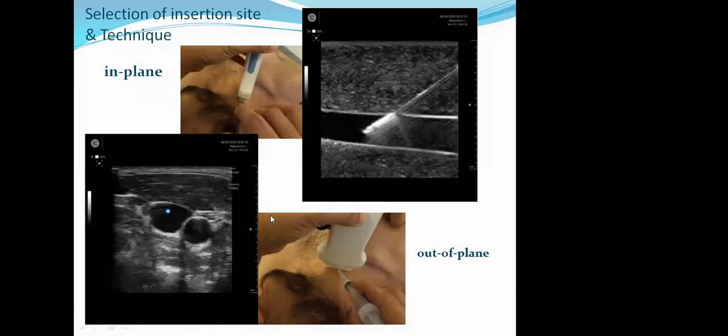In the out-of-plane technique, you keep the probe in a transverse plane and keep the needle right in the center of the probe, at a 45-degree angle. When you insert it, you will see the needle in the transverse plane as a small white echogenic dot. You will not be able to see the entire length of the needle, just a small dot.